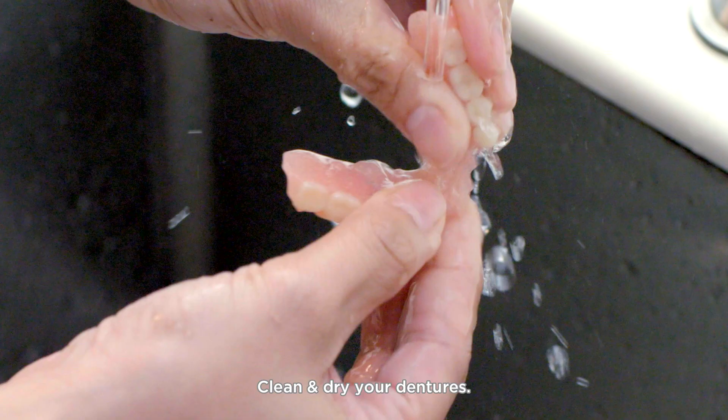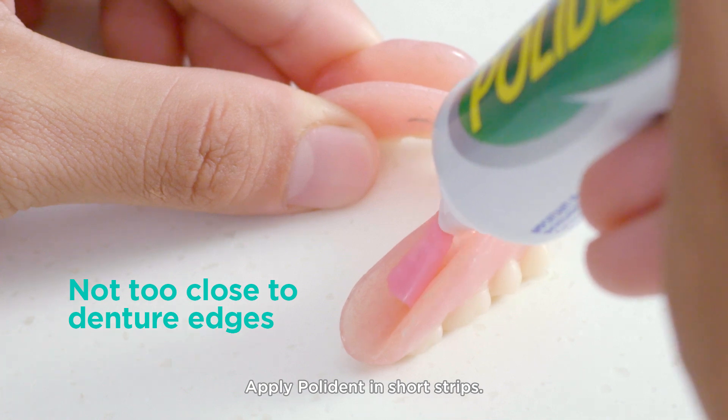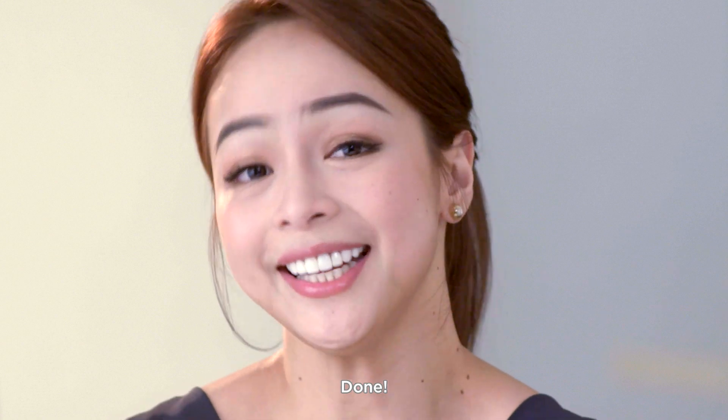Just three simple steps. Clean and dry your dentures. Apply Polident in short strips. Bite down for a few seconds to secure hold. Done!